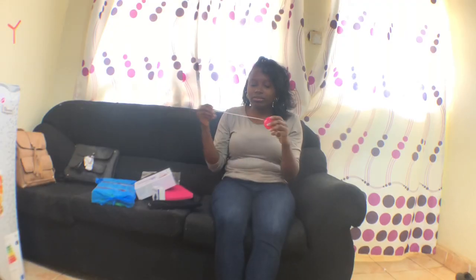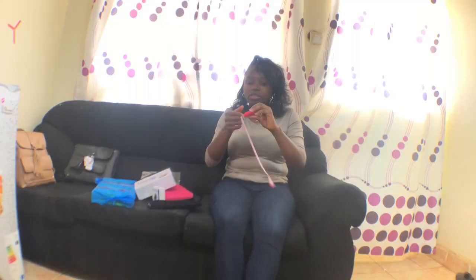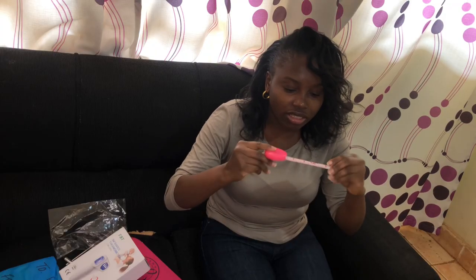How cool is that? This is the tape measure. You need a tape measure in everything in medical school, to measure a pregnant woman, to measure the head circumference of a child, to measure everything, to measure wounds. I'm so happy about this one. It has both centimeters and inches.